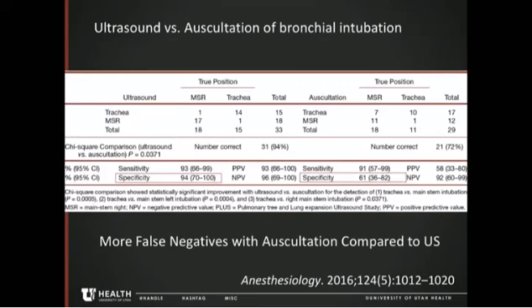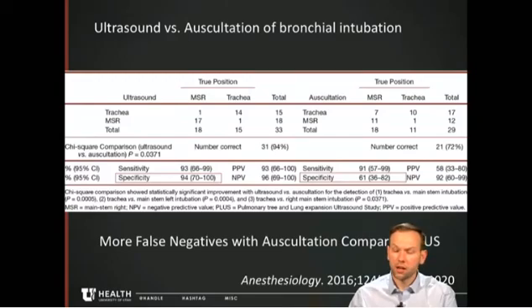So this shows another opportunity using the principles that we saw to rule out pneumothorax, that in the absence of lung sliding but the presence of a lung pulse, you can make the diagnosis of bronchial intubation, and then instead of putting a chest tube in a main stem patient, you can pull the tube back, resolve the problem, and again, you're avoiding those false positives and the repercussions therein.